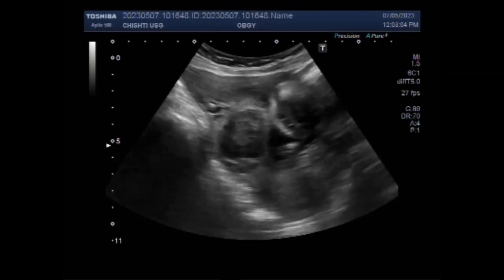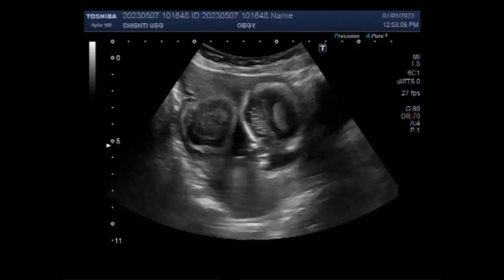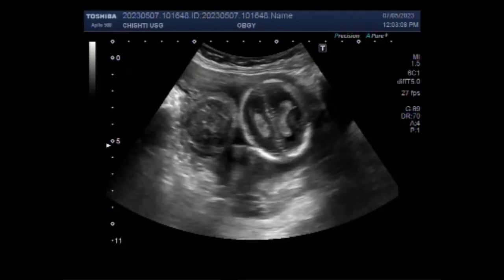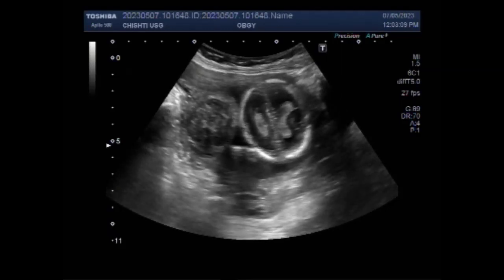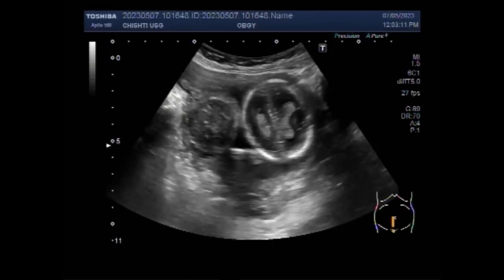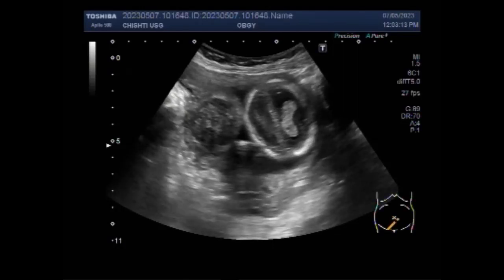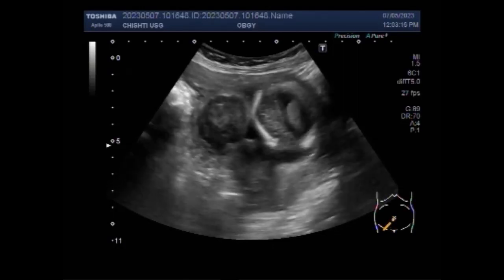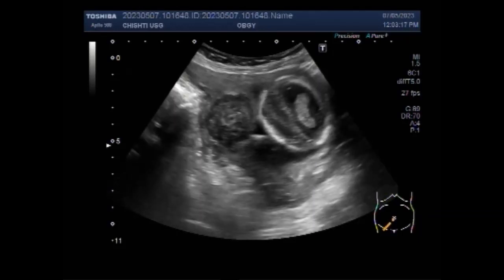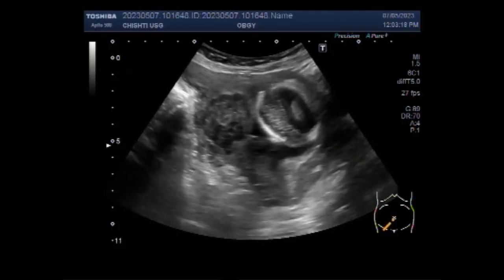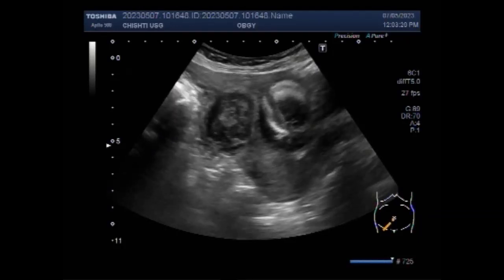Surgery to remove an ovarian mass can be done either open or laparoscopically. Now you can see the ovarian mass as well as the pregnancy. This is a round oval mass, semi-solid to solid in consistency.